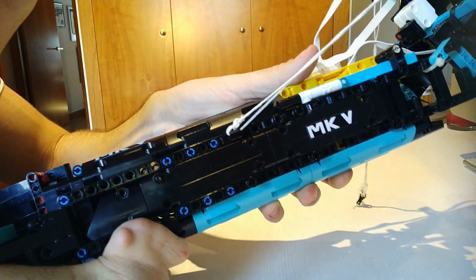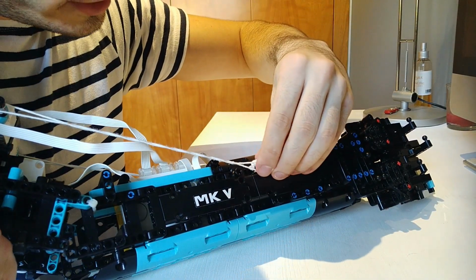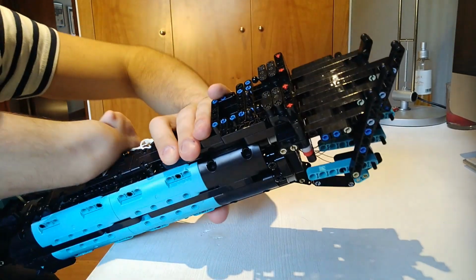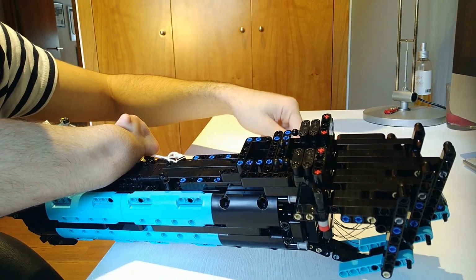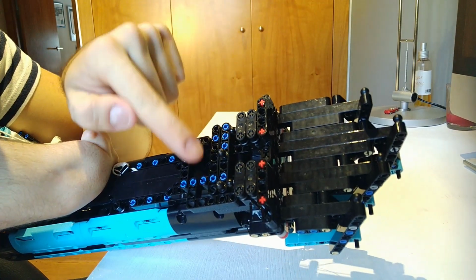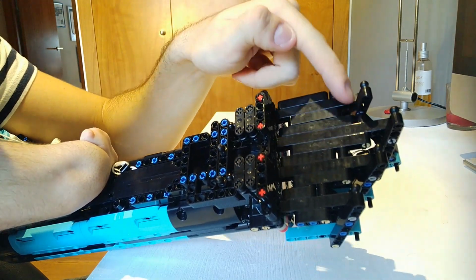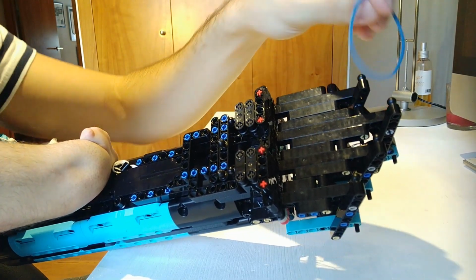Right here. And the other one on the same spot, but on the other side. The last step is connecting really small rubber bands to the fingers. So you can actually see there's two balls right here. I don't know if you know the brick, but it's this little ball right here. And there's actually 4 other balls right here. So you need to connect each finger to the balls right here. For example, this one is going to the center finger. So we're going to do that.